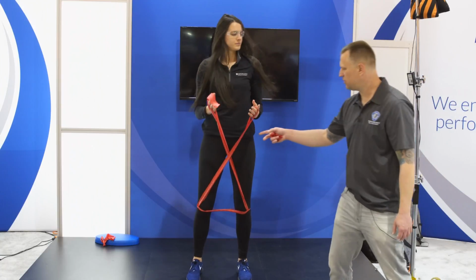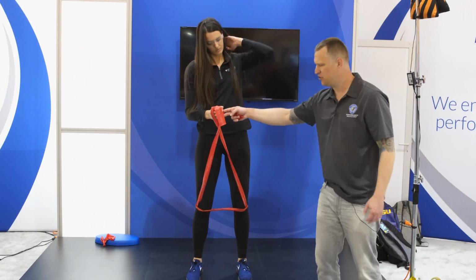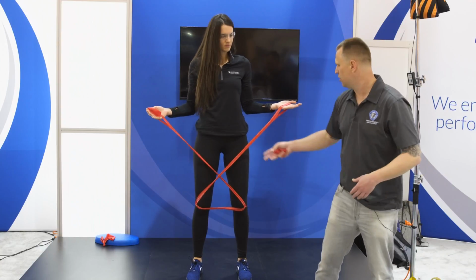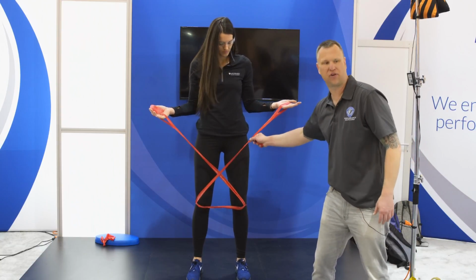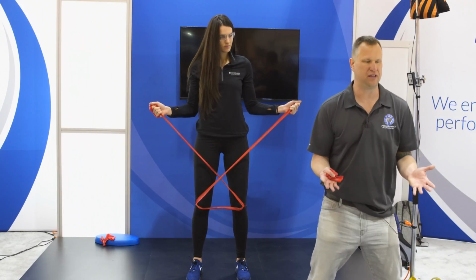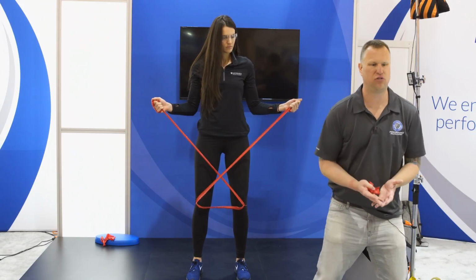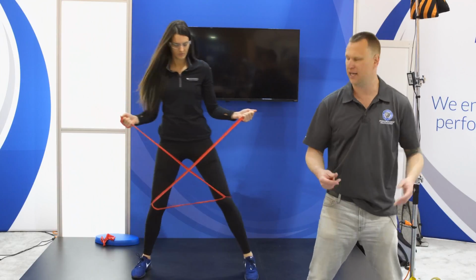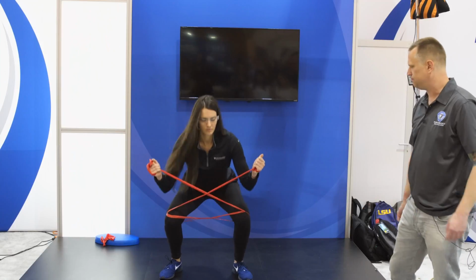Okay, and maybe in that situation with the advantage of the CLX is you maybe say, you know what, I want to keep a little bit more load on the shoulders in the back extensors, so I could have her stay here. I might even have her with her hands shorten up the loops, even 1 or 2 loops, and it's because we've essentially given her more band to work with, and she could do those same exercises. She could do side to side, she could do some prolonged squatting and coming back up into that position.